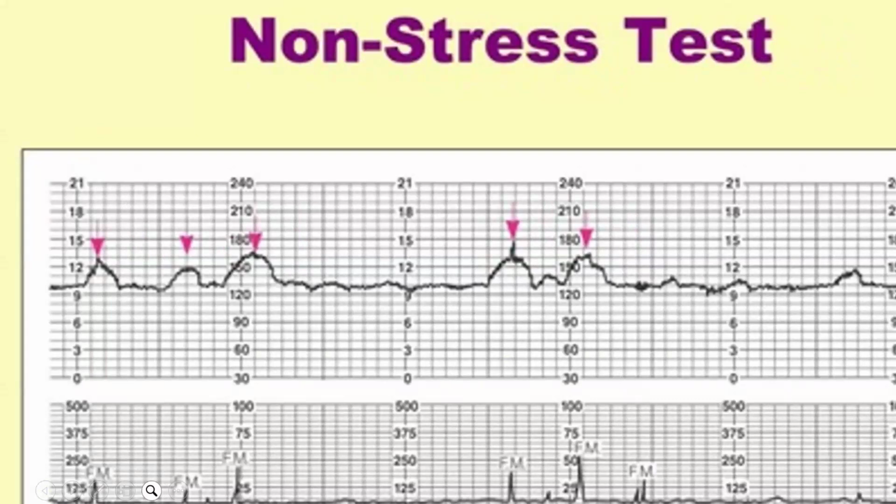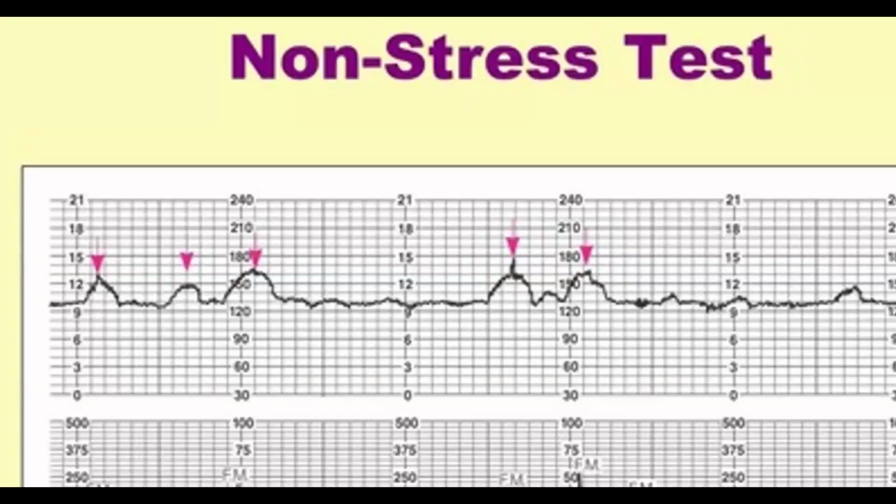Yes, correct. So what we have to do is exclude the upward flicks and the downward flicks. So no accelerations, no decelerations. Correct.